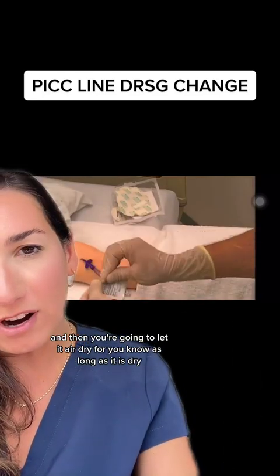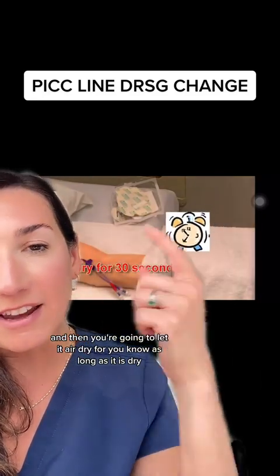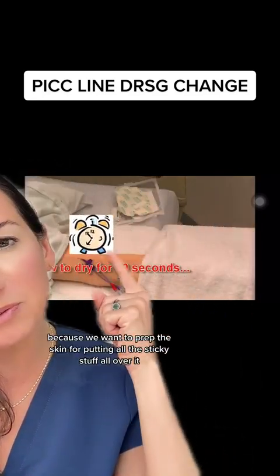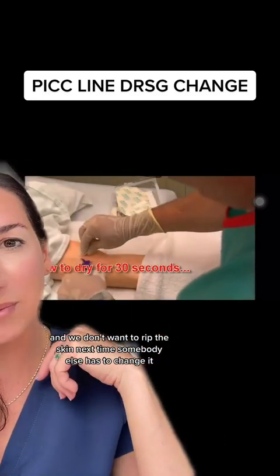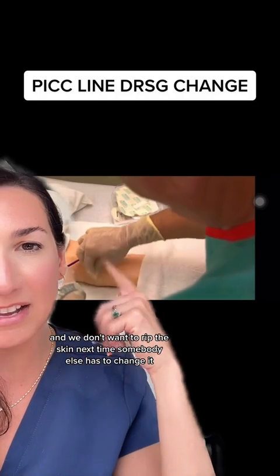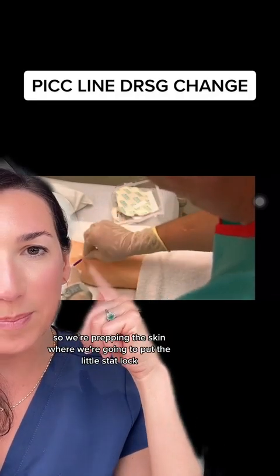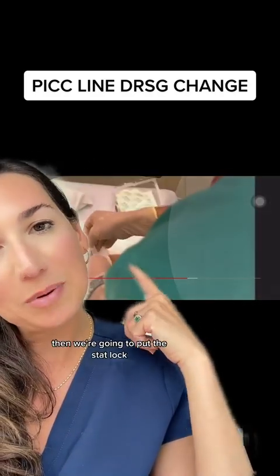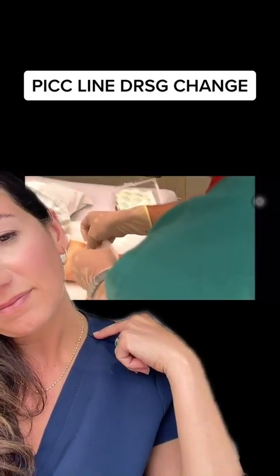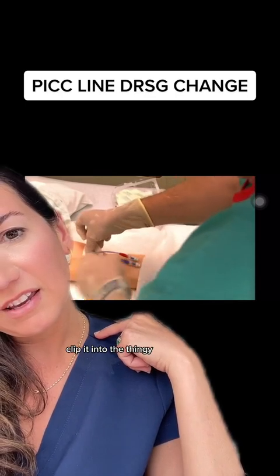Now use skin prep because we want to prep the skin for the adhesive — we don't want to rip the skin the next time the dressing is changed. Prep the skin in the area where you're going to place the stat lock. Allow it to dry, then place the stat lock and clip it into the connector.